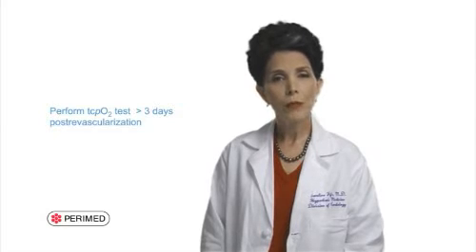However, the increase in baseline pressure values after revascularization may be delayed, so post-revascularization TCPO2 studies should not be performed until at least 3 days after the procedure, and preferably more than a week. The reason is that TCPO2 values can continue to increase for as long as 28 days after revascularization.